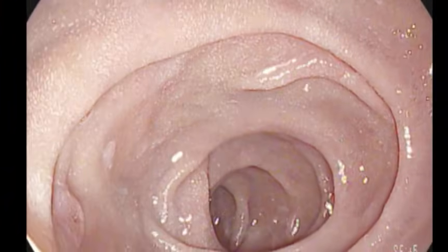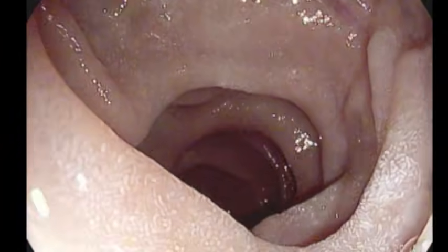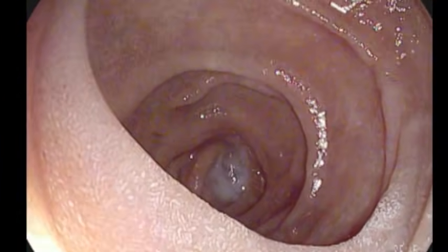At this point in the upper endoscopy, the scope is located in the jejunum. Though there is no distinct epithelial transition from the duodenum to the jejunum, the location of the scope can be inferred by the high number of plica circulares.